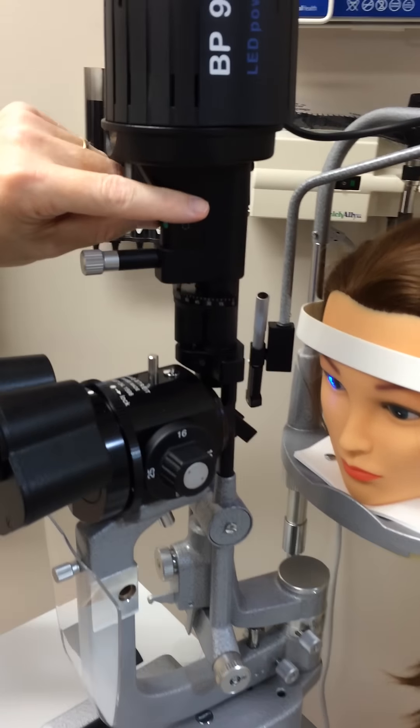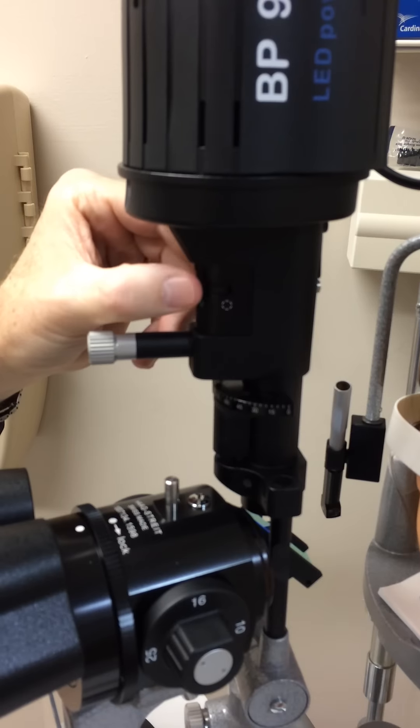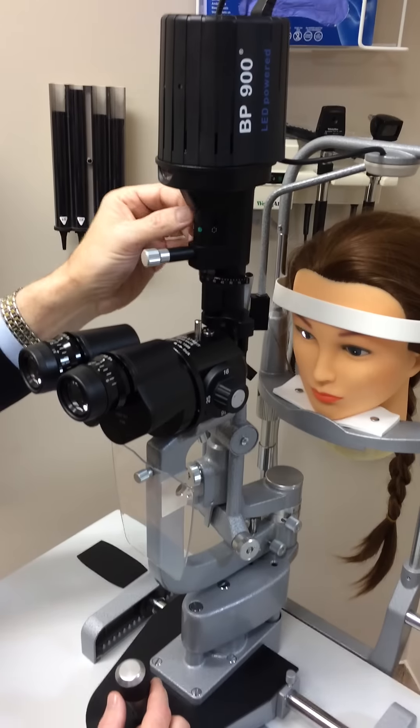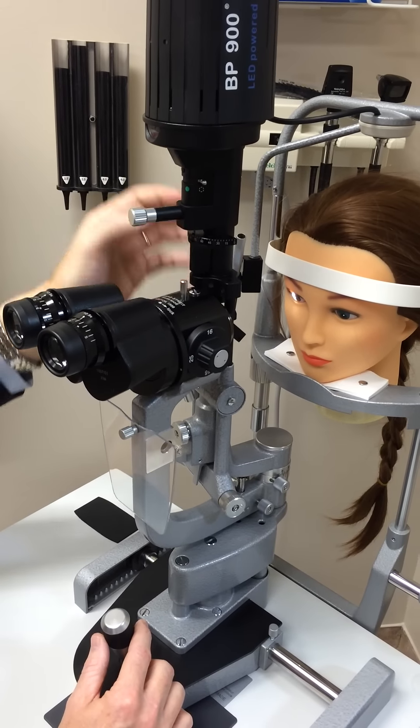The switch up here you should almost never need to use. This is for the brightest white light. Green we never really use. All the way over is the less white light. You really don't have to use this switch at all — keep it all the way to the right, which is probably the best place.